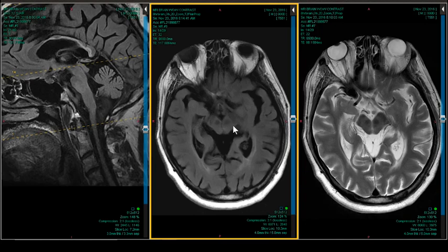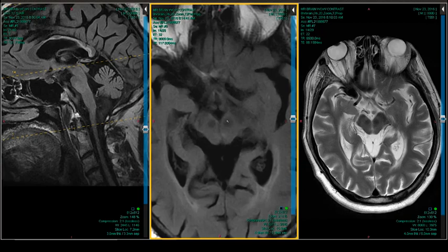Okay, and the zona compacta stripe, so if we're thinking Parkinson's, is intact. Let's blow that up a little bit so they can see a little better. So the separation between the red nucleus and the substantia nigra, this whiter, brighter area, should be intervening between the two. They shouldn't bleed together. And they would in end-stage Parkinson's like this, and they don't. And here's your nigrosome. We'll talk about that in a future case.